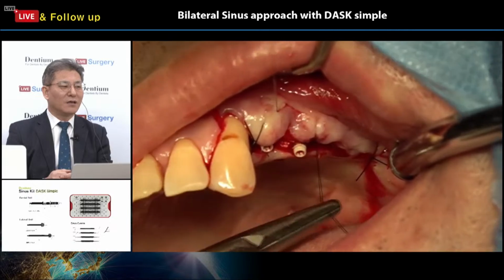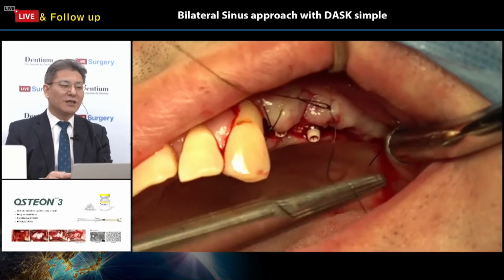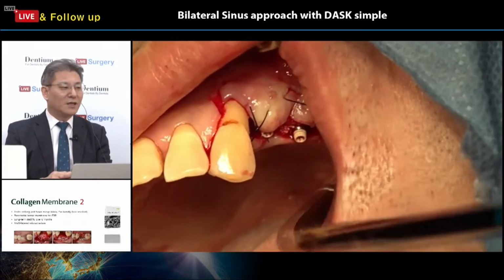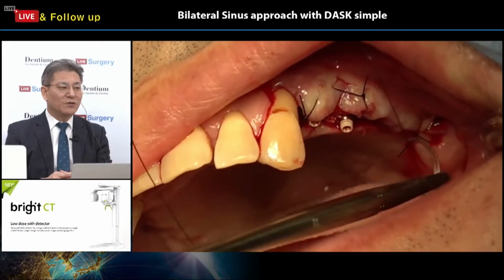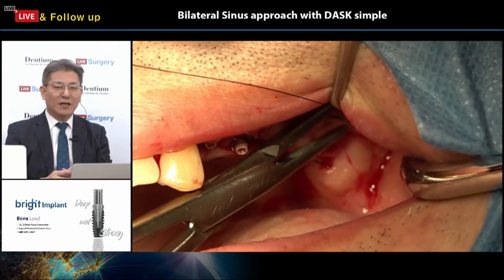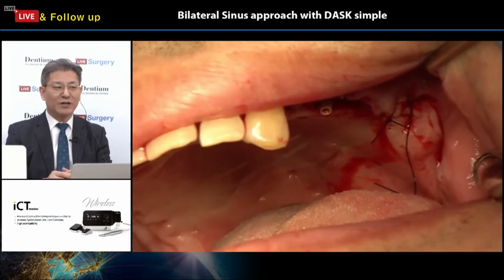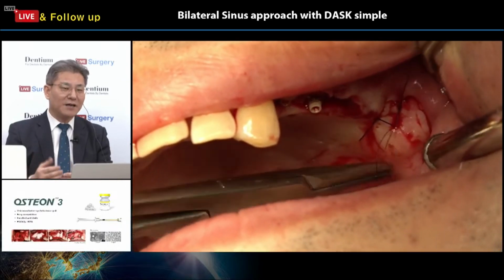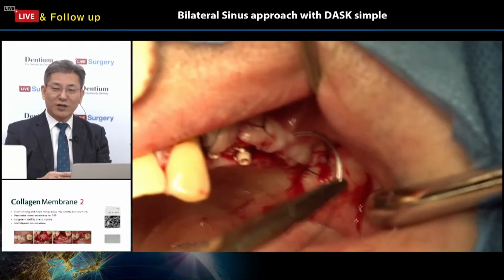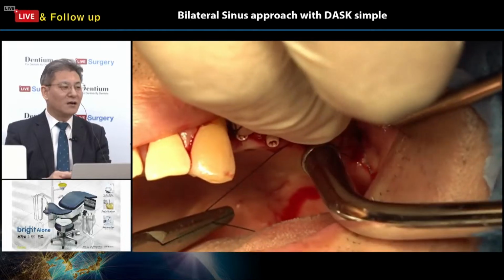Actually, I want to say a little bit more about adding this procedure. For me, if possible, connective tissue grafting on the labial site of the number 24, 25 area is better because, as you know, the collagen graft does not have enough barrier function. So at this time, if we can harvest the connective tissue from the palate or the maxillary tuberosity area, I think the healing potential and the protection abilities will be higher, right? So we can try. You can try harvesting the connective tissue and then put the graft materials on the labial site of the number 24, 25 area.